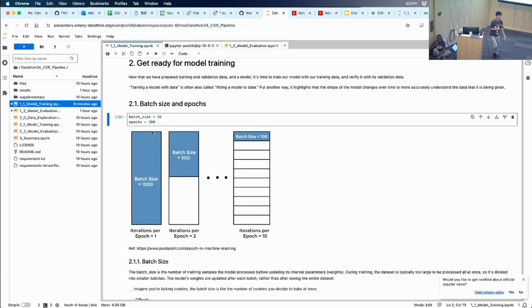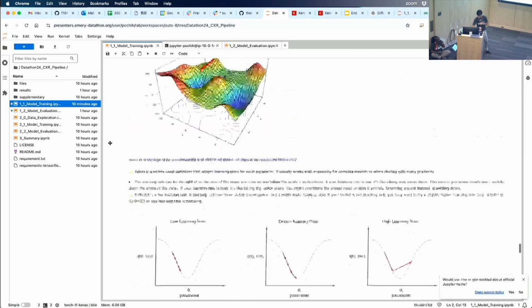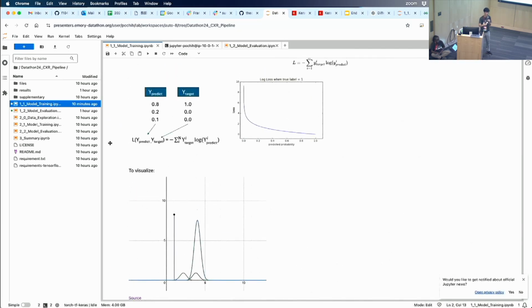What do you mean by loss? Like what kind of loss? Oh, the loss is like what I just mentioned. You can calculate the difference between your ground truth and your prediction. So for example, I get a single image. I will use this image to train our model to adjust the parameters. So I put my image into my model and I get a prediction like 0.2, but my answer is 1. So the difference might be something like 0.8. That is my loss. Okay. Yes.